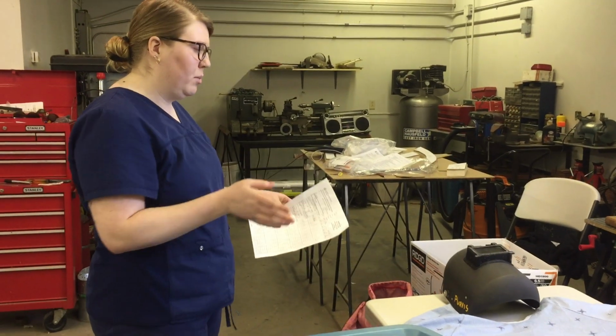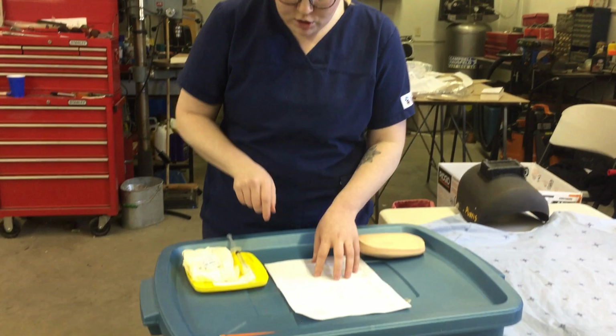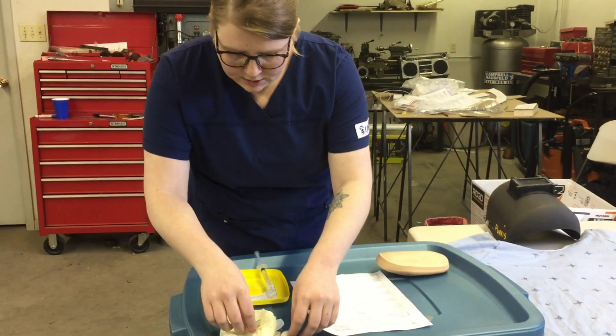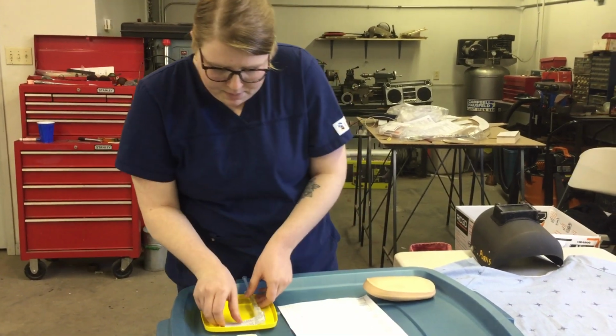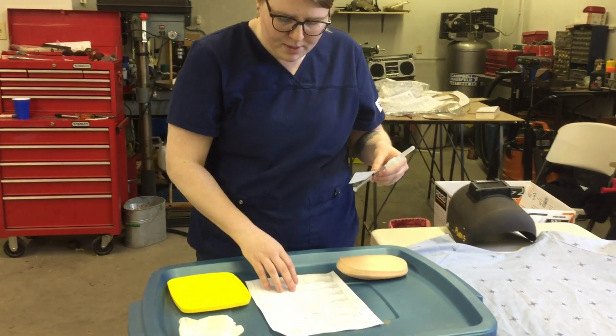At that point, I'm just going to let him know I'm going to do my 3rd check, and then we will give him his injection. So from here, I'm going to do my 3rd check. I'm just going to set up my table here. I'm going to get my syringe, my label, and my MAR, and I'm going to be comparing the 3 for my 3rd check.